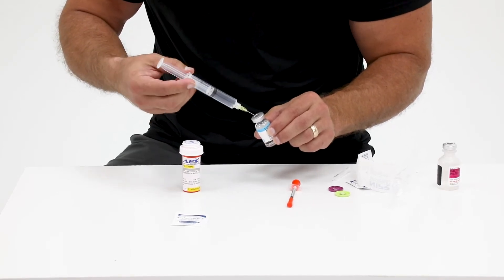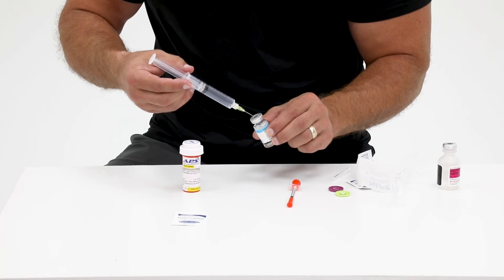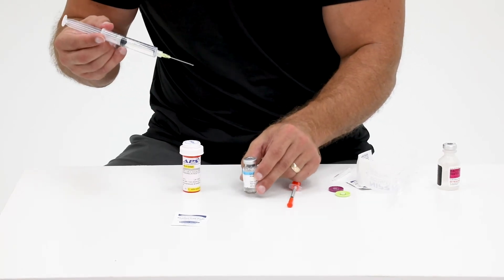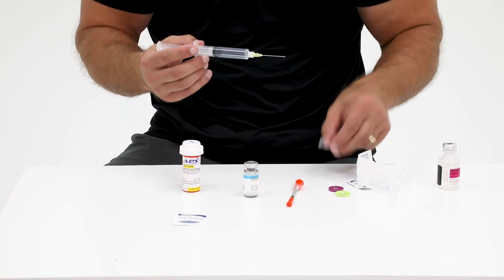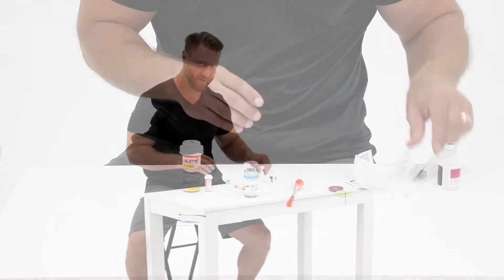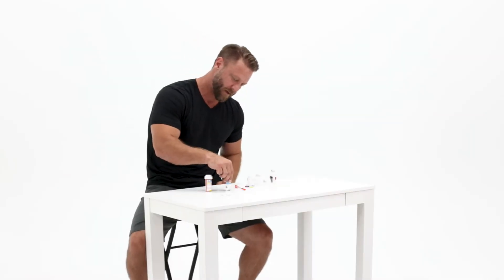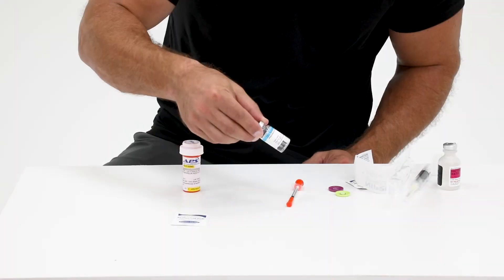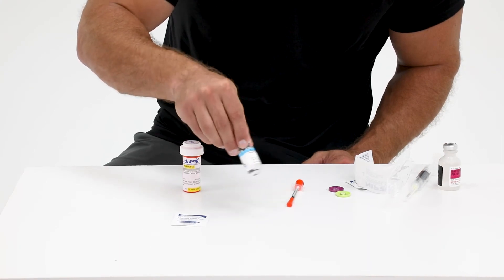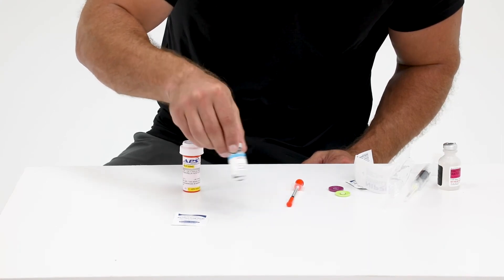Once all of the water has been pushed into the lyophilized vial, carefully remove the needle from the vial. Place the cap back onto the syringe and discard the needle. Lastly, gently swirl the vial of bacteriostatic water and lyophilized powder until all the powder has been dissolved into the solution.